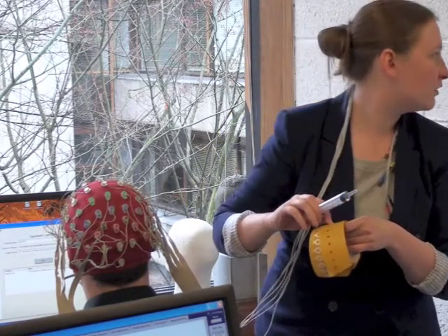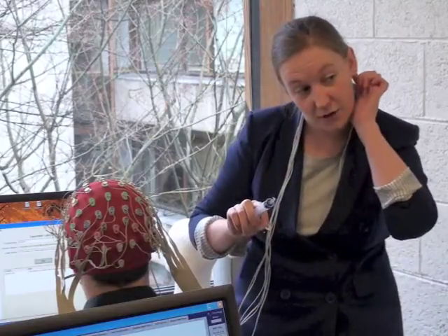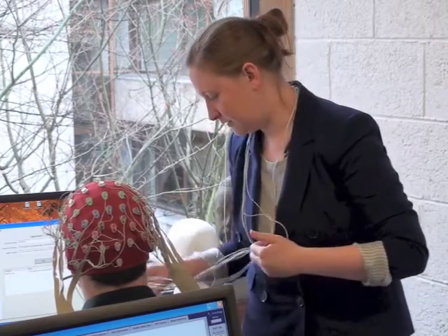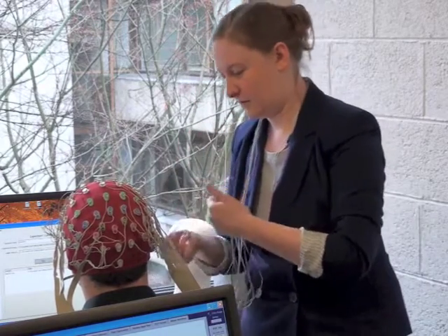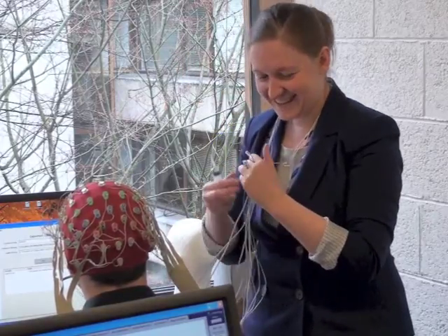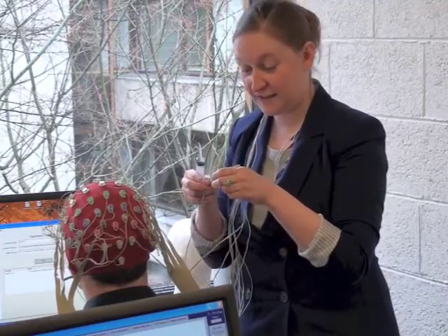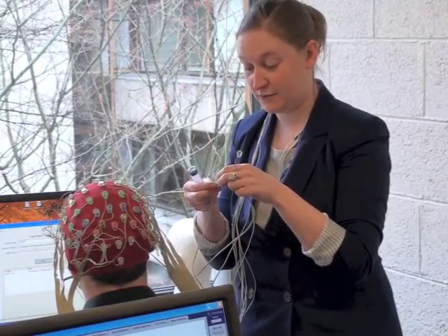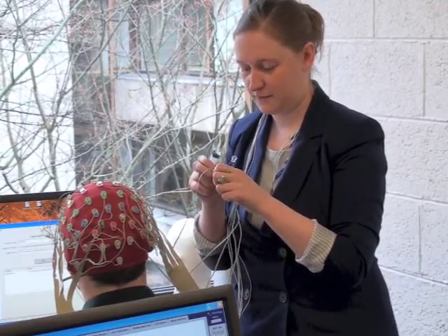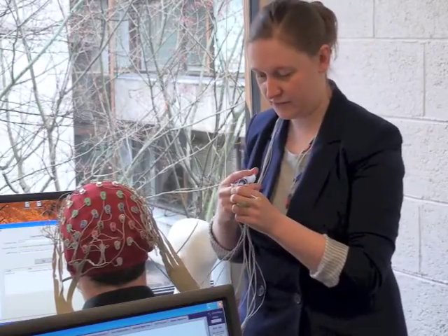3 and 4 go on the mastoids. The mastoid is the bone just behind your ear that comes out there. So, following our convention, 3 goes on the left mastoid. Stop laughing. 3 goes on the left mastoid. You can have these little double-sided sticky things set up before the participant comes in as well. That's another time saver. Even just for a selfish reason, the longer they're here, the more they're going to move and mess your data up.